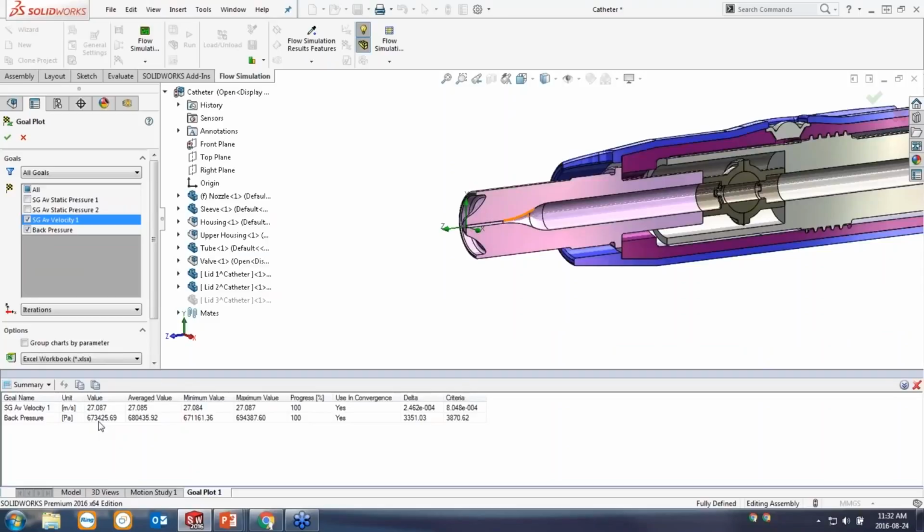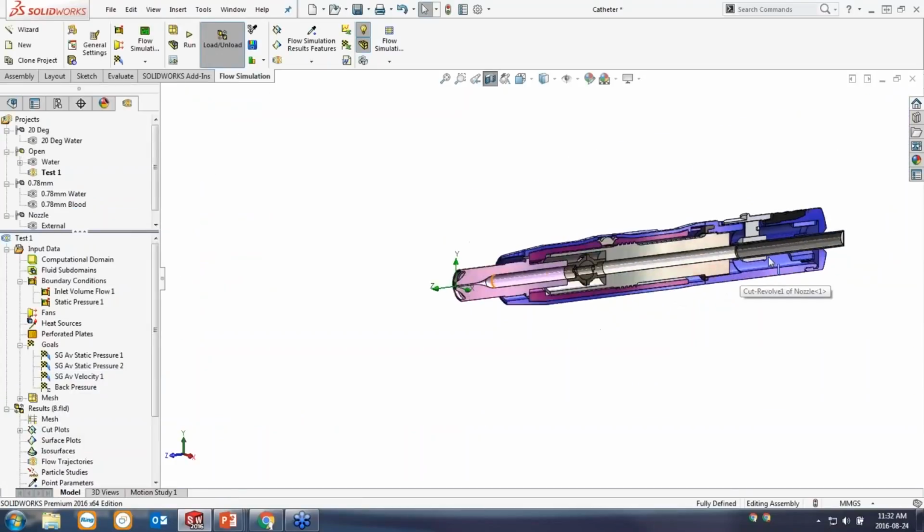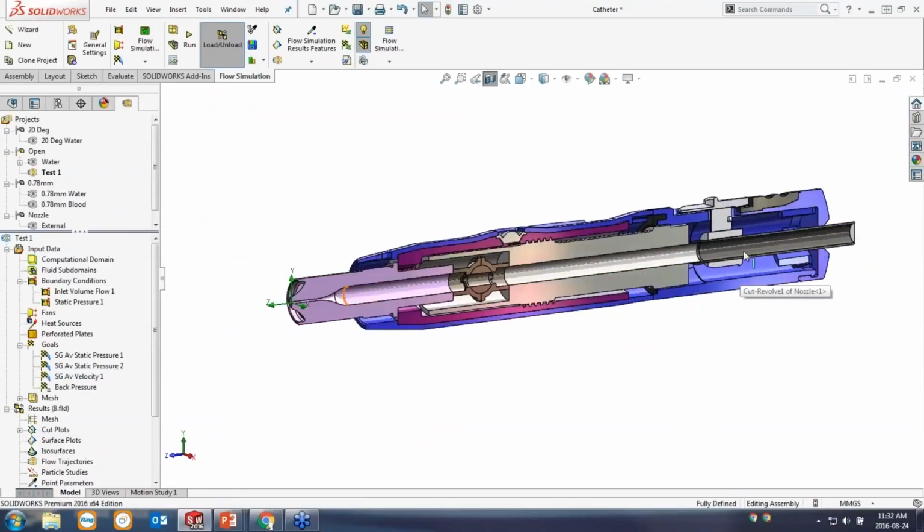And my back pressure, it's 673,000 pascals or 670 kilopascals. We set a maximum of 100, so that's clearly too high as well. I'm not going to have the power needed to drive the flow rate that I'm looking for. So right away we can see that this design doesn't meet our requirements. So the next thing that we do is we go and improve our design to meet the requirements. That seems like the natural progression.